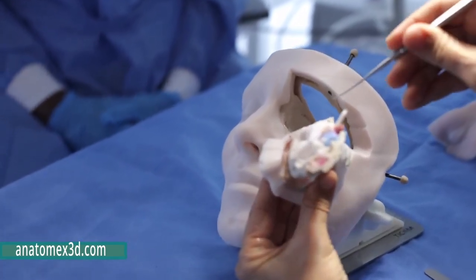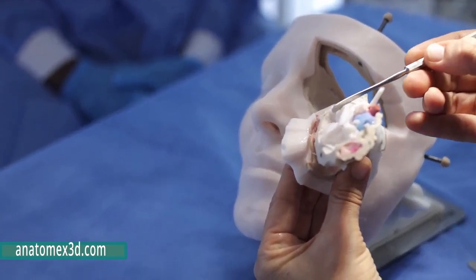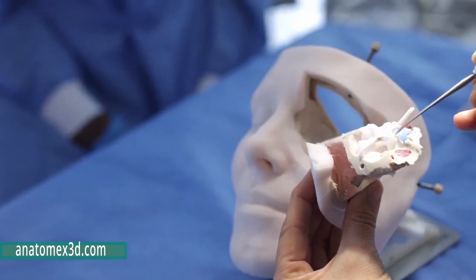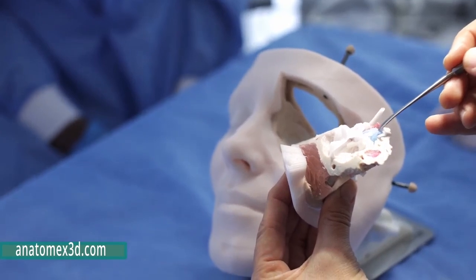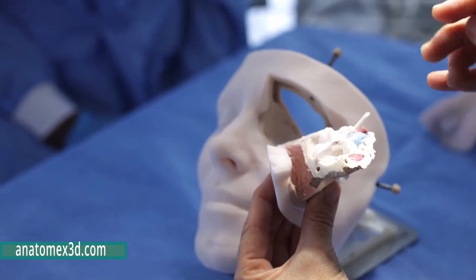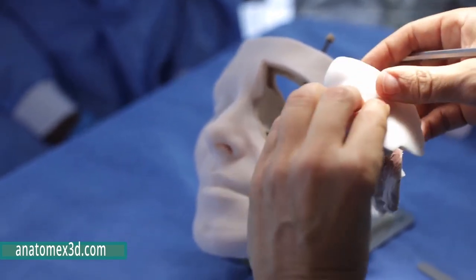Once we've breached the greater wing of the sphenoid and we access this space, we need to see the V1, the V2 and the V3. You have to see all of these structures. Here you can see the cavernous sinus, we can see the carotid artery, and we're going to aim to dissect this in a real life situation.